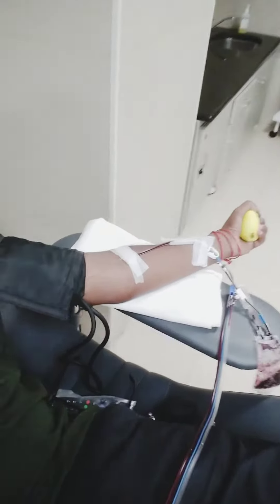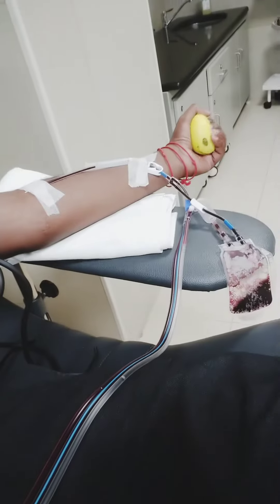Hello, welcome back. Today we are doing a video about blood donation. I am going to talk about SDP. SDP is a single donor platelet. Our hospital staff — a Dengue patient has a platelet count of 26K, so we need to transfuse it immediately.